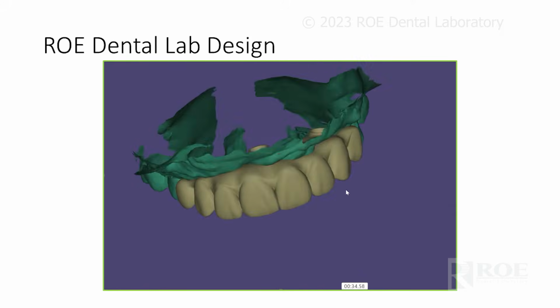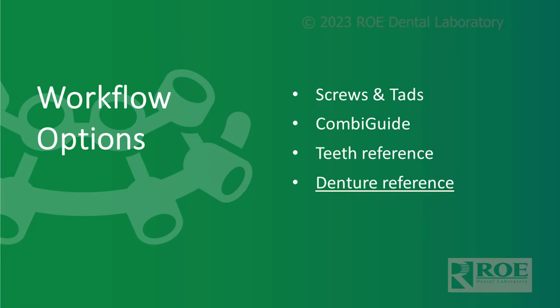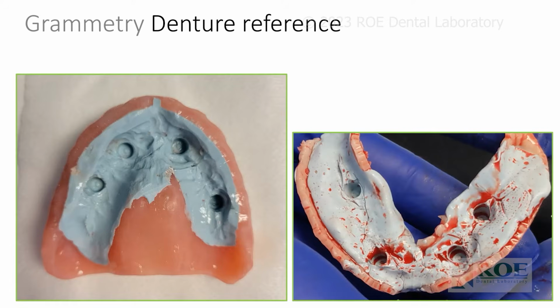All right. Yes, we like this. Okay. The last modality. Now, there's different ones that doctors have developed, but these are the main ones that we teach, that we espouse. So, the denture reference. A lot of offices now are just ordering a denture, right? An immediate denture for capturing the records because it's very familiar, right?